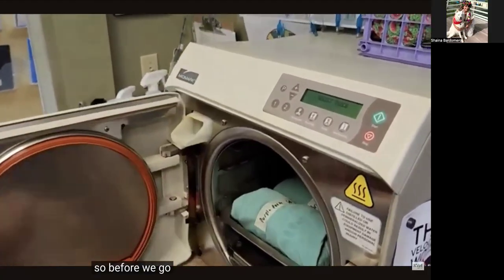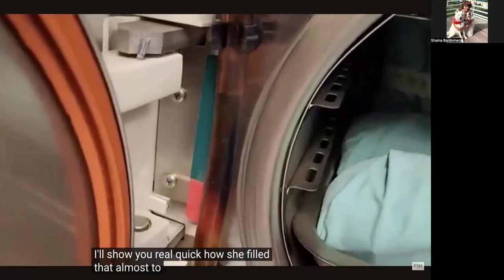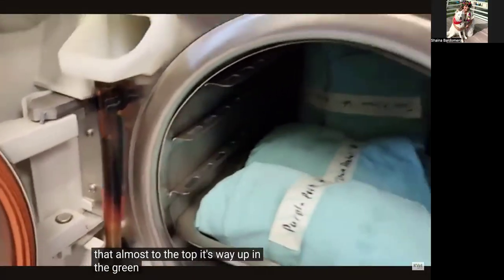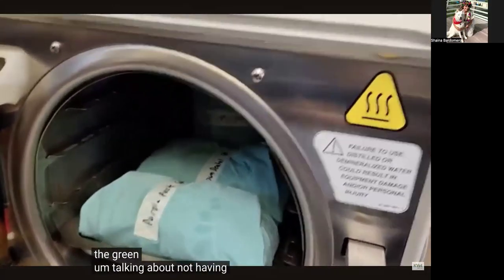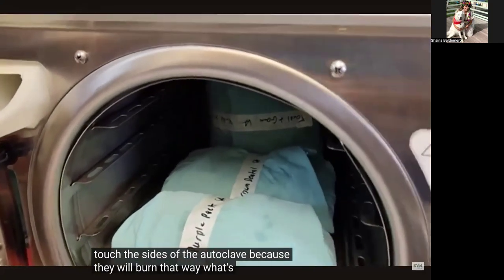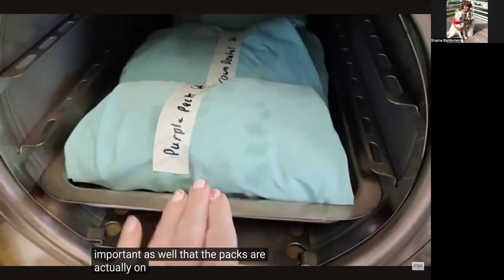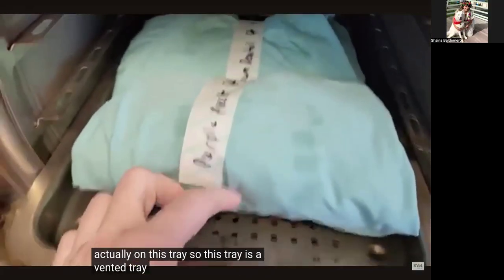So before we go on to the next thing, I'll show you real quick how she filled that almost to the top. It's way up in the green. Talking about not having the packs touch the sides of the autoclave because they will burn that way. It's equally important as well that the packs are actually on this tray. So this tray is a vented tray with holes in it.